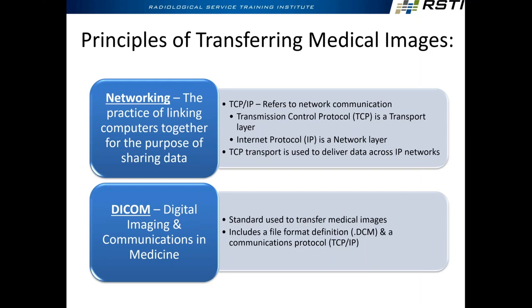The two principles of transferring medical images, we have networking and DICOM. Networking are the rules and the protocols for TCP/IP. DICOM does not deal with IP addresses or anything to do with the network. The whole point of this slide is DICOM is not a protocol to send data on the network. TCP/IP does that. We rely on TCP/IP to get the information from point A to point B. DICOM is just a structure of how that data is organized.